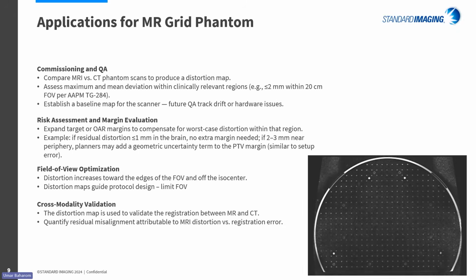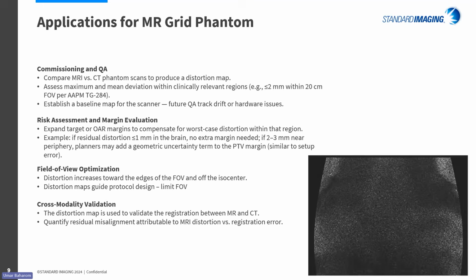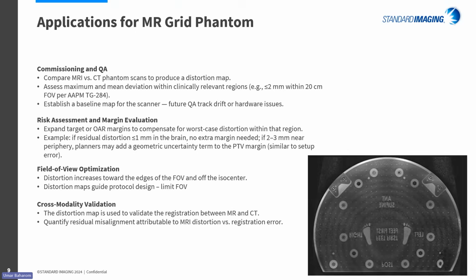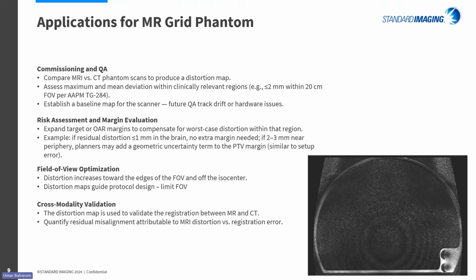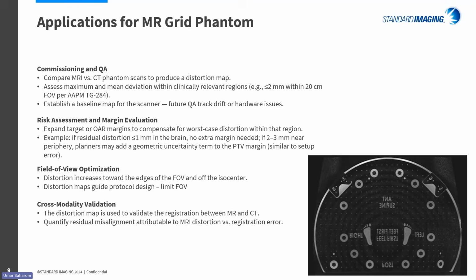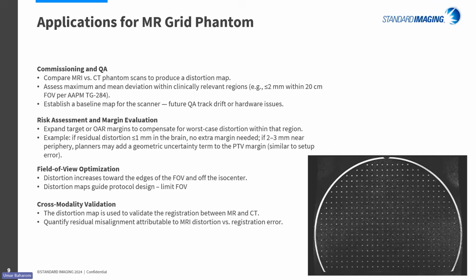There's a cross-modality validation as well. You can use the distortion map to validate your registration between MR and CT, like I talked about earlier with commissioning QA. You can also quantify the residual misalignment attributable to the MR distortion versus your registration error.